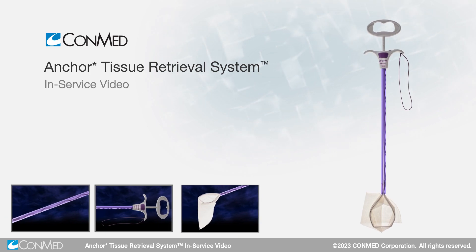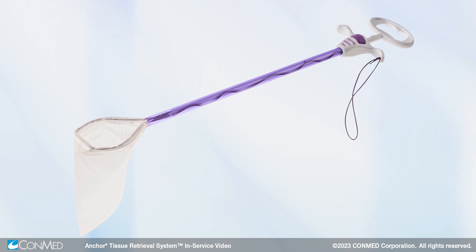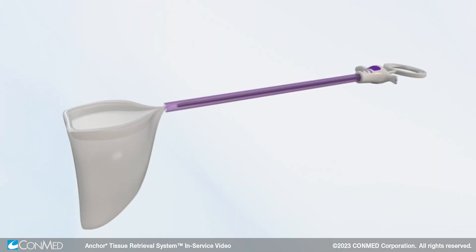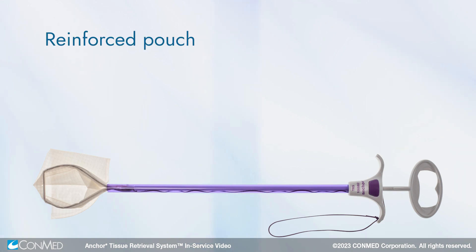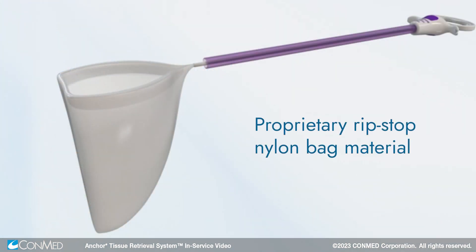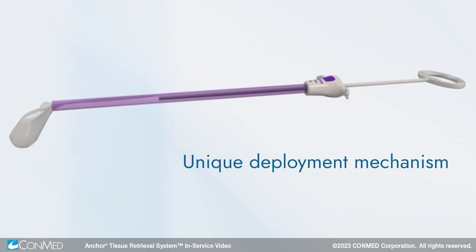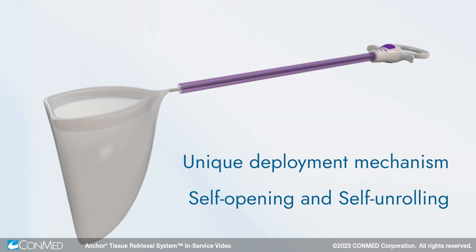The Anchor Tissue Retrieval System is a premium, reliable, redeployable specimen bag for use in both laparoscopic and robotic cases. The system consists of a reinforced pouch with a dedicated introducer for the capture and removal of specimens from the body. Anchor features a proprietary ripstop nylon bag material, unique deployment mechanism, and is self-opening and self-unrolling upon deployment, saving time during procedures.